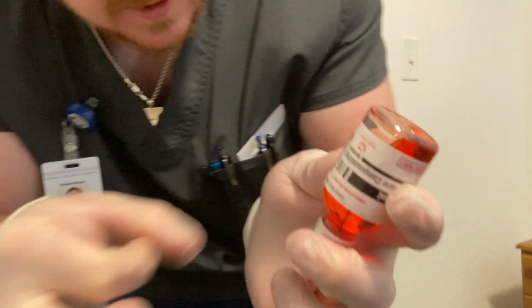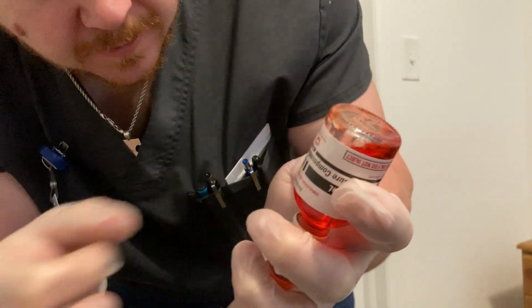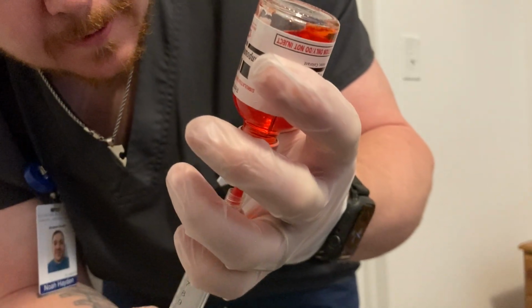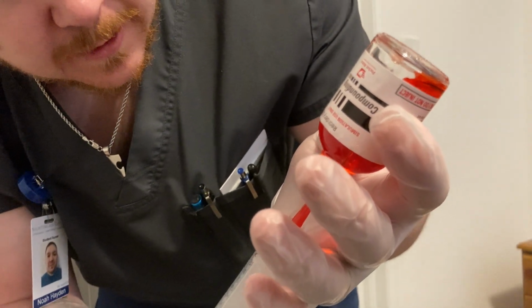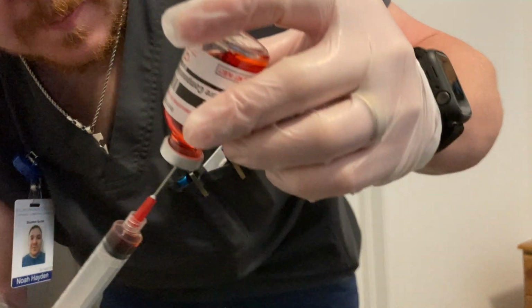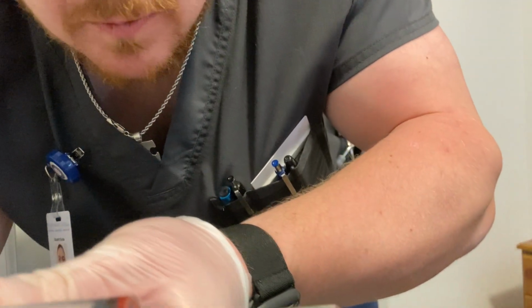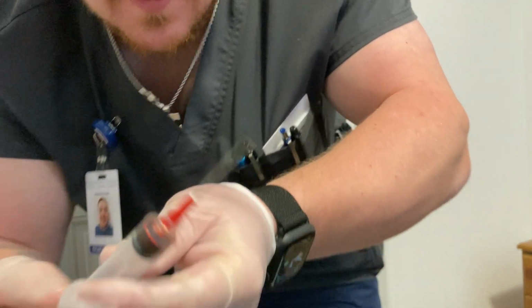I'm going to remove any air bubbles by tapping, while maintaining sterile technique. Make sure that I have 1 milliliter of solution, no air bubbles, and withdraw my syringe. Verify I have 1 milliliter of heparin solution, which will give me 1,000 units of heparin.